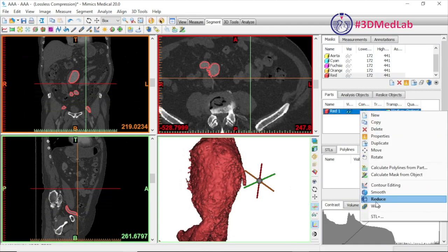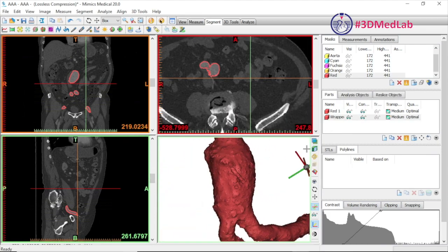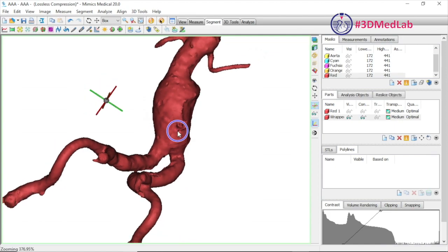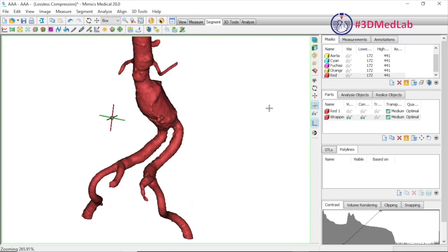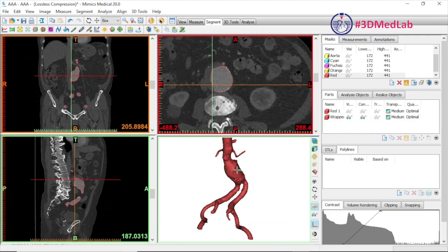It looks a little bit rough, so we're going to use the wrap function, which creates an outside shell and removes some of the internal hollowings. If we turn off the first part you can see the smoother wrap that has been created. I'll just point out this divot on the model — this is because we've picked up the contrast lumen and there is a rim of thrombus within the aneurysm sac that hasn't been picked up by segmentation. If you want to capture that you'll need to do it manually, but for our purposes we just want the hollow lumen, and that will do it.